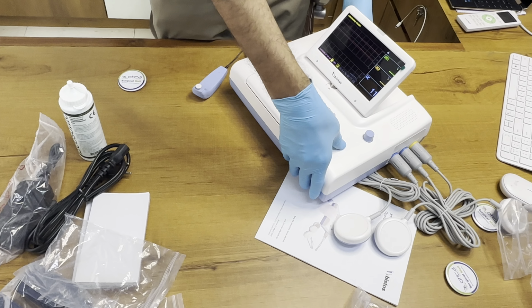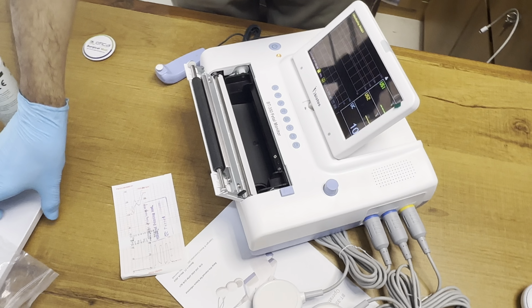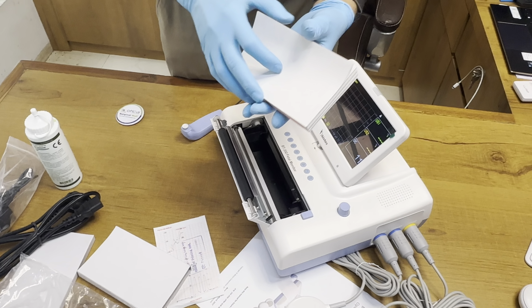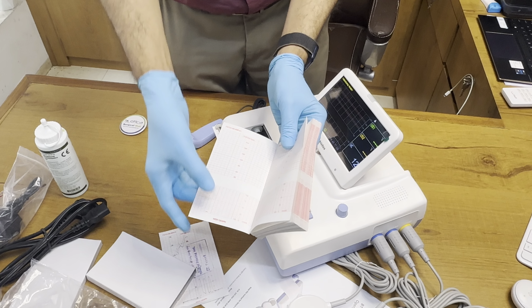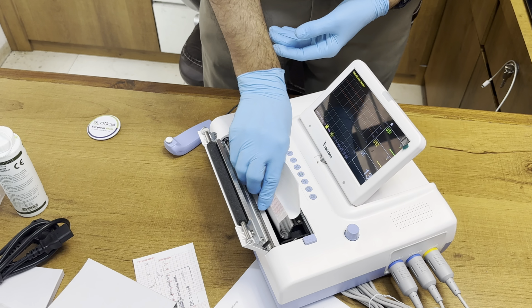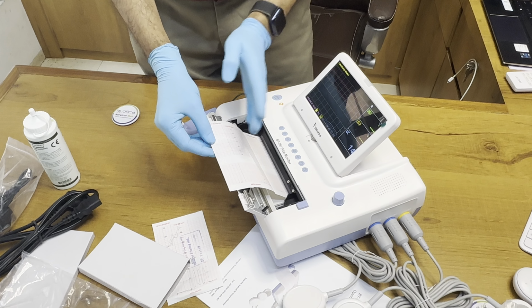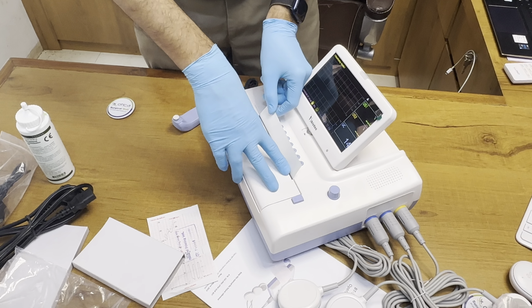Now I'll help you push the button. You need to put the paper. This is the testing paper. I'm just trying one probe. You just need to make sure that you are putting the paper so that the ink printed side will be on the side of the machine, not on the side of the door. This is how you need to keep the paper. This has to face toward the display, not this side. Now we are closing this lid.